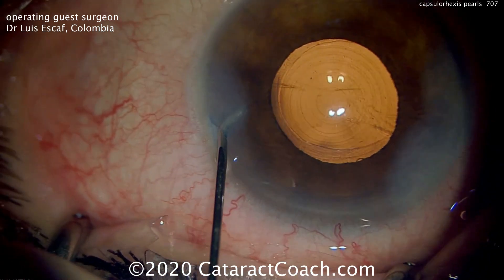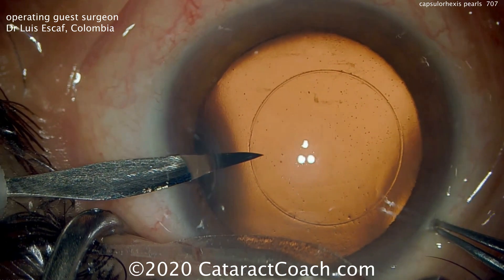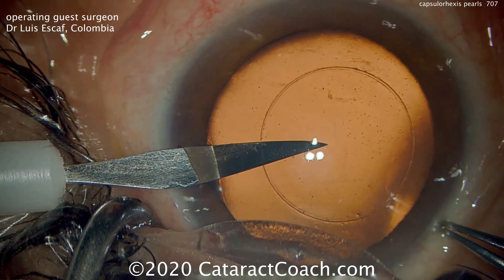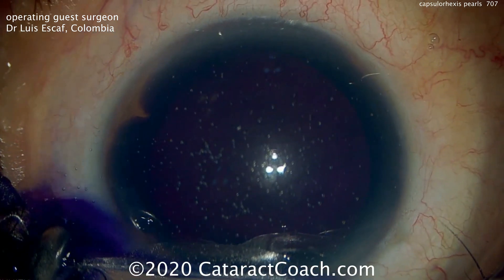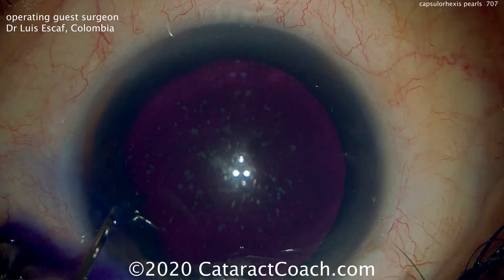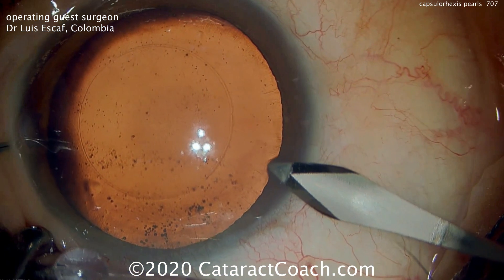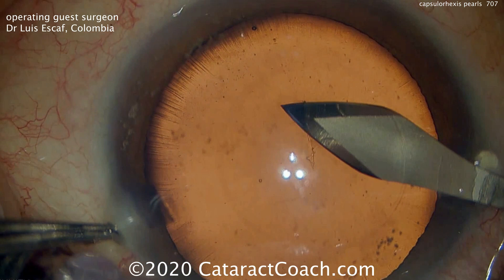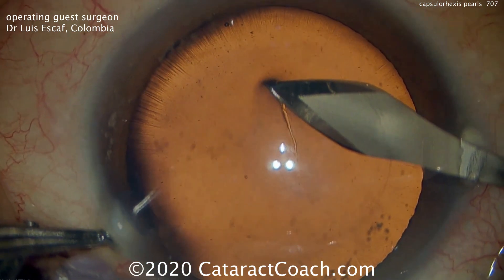Great technique. Two things that we learned: one is using the marker to plan out the rexis. Here's a case where the marker has been used to make a little indentation in the corneal epithelium. Because of magnification effects of the cornea, a 5.5mm mark on the surface of the cornea corresponds to about a 5mm mark on the anterior capsule. There's the same blade going in — be careful not to inadvertently enlarge your incision when you do this.